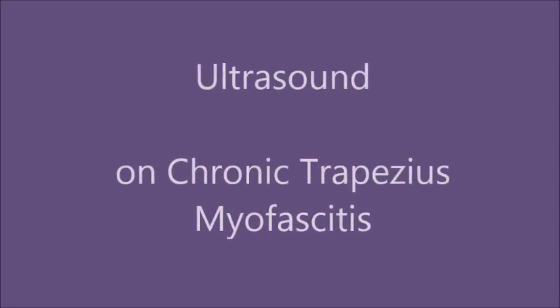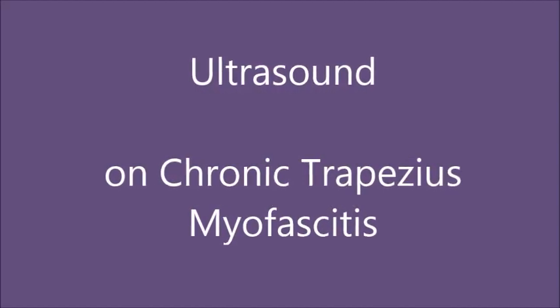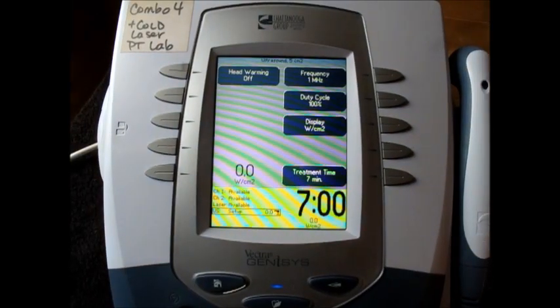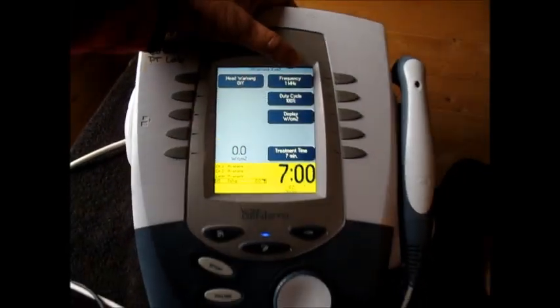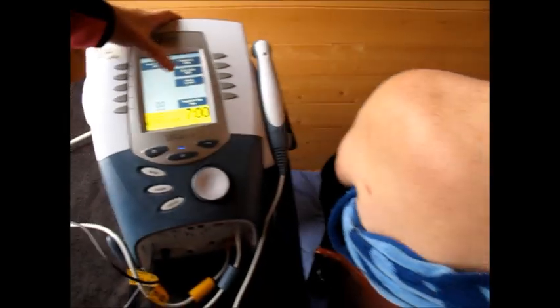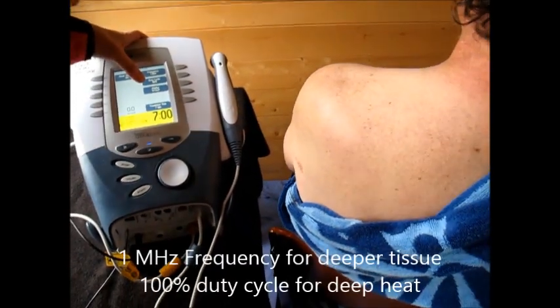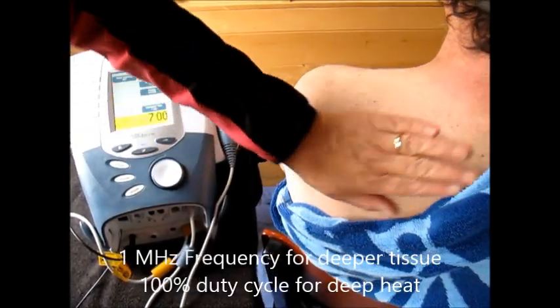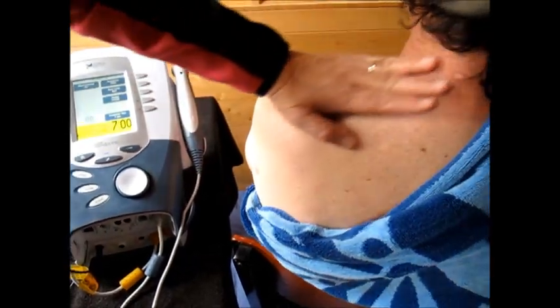This demonstration is going to be doing ultrasound at a frequency of 1 MHz, duty cycle 100%, which would be continuous ultrasound. We're going to be putting some warm, deep heat into this trapezius that is very sore in this patient.